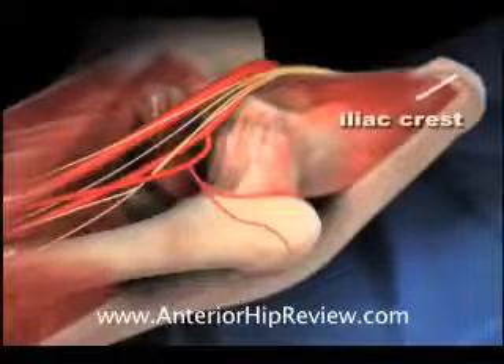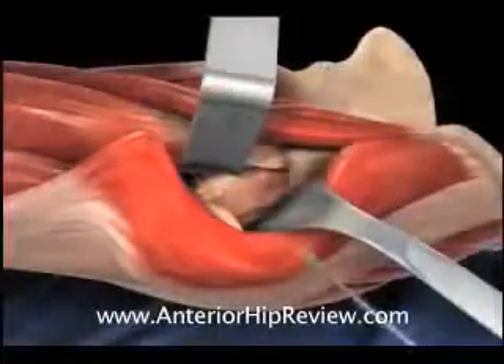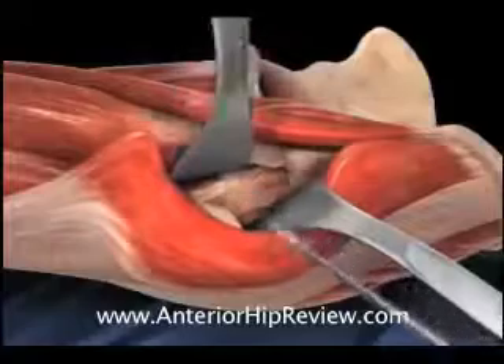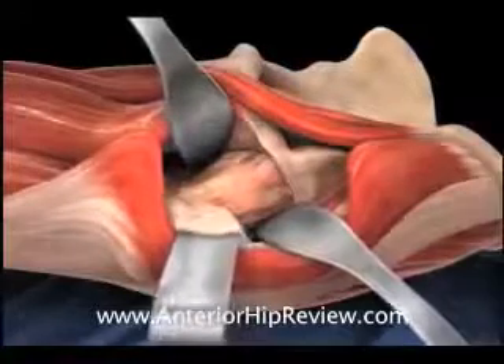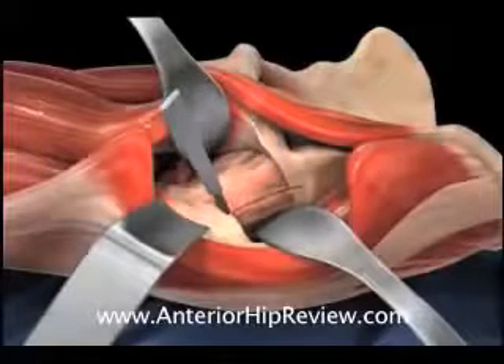Once the incision is made, soft tissue retractors are placed in front of and behind the femoral neck, facilitating exposure of the hip joint. A scalpel is used to create a release of the capsule, opening the joint and exposing the femoral head and the acetabulum.